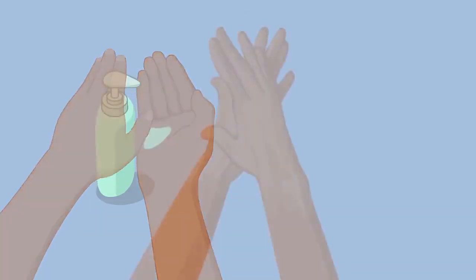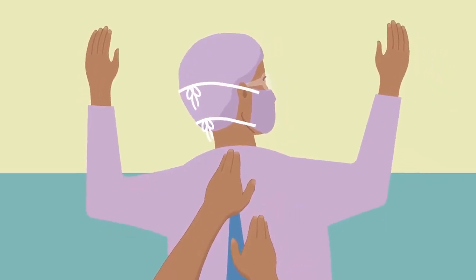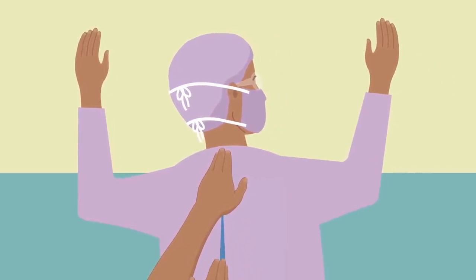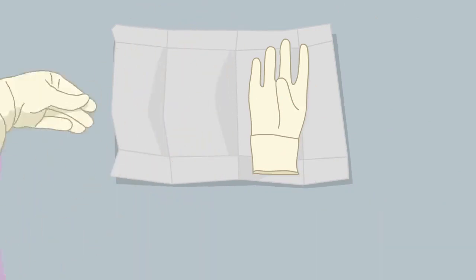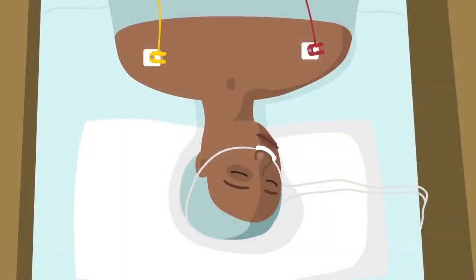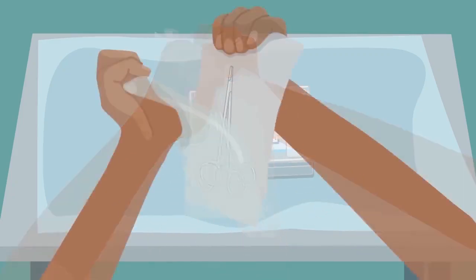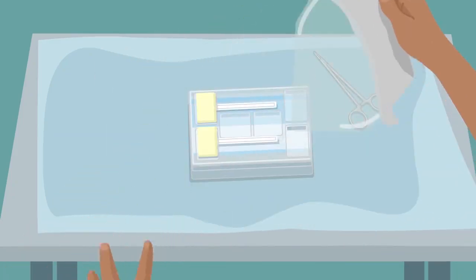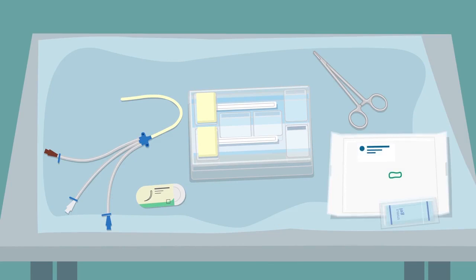After hand hygiene, the physician moves to sterile gowning under the surveillance and help of the assisting nurse. The physician puts on a new pair of sterile gloves. Application of a small sterile drape at the access site is followed by unfolding a large sterile drape to cover the entire patient. The assisting nurse adds needle driver, sutures on a curved needle, the central venous catheter, the ultrasound cover, sterile gel, and gauze to the insertion kit.